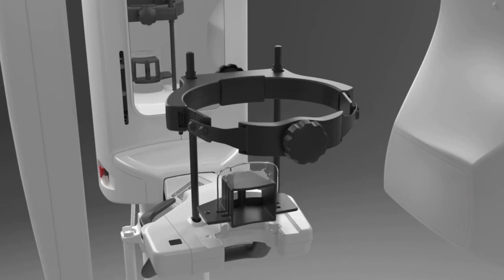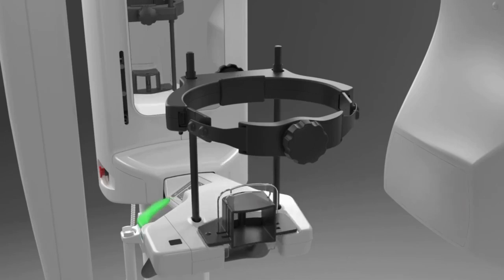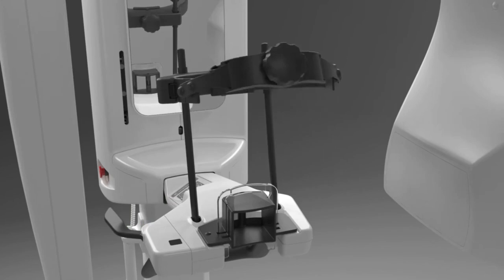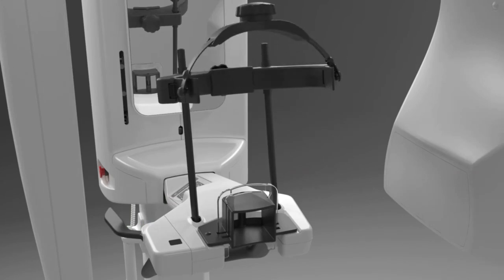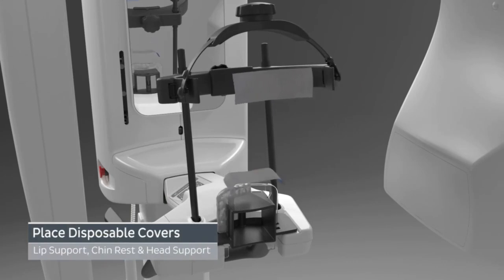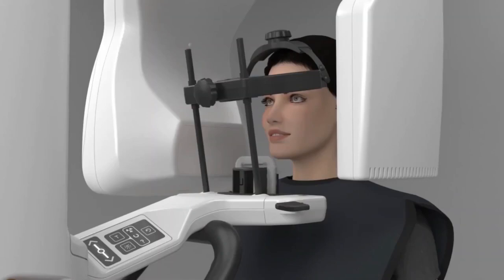Also, those moving solutions try to project the teeth arch as orthogonally as possible. It is impossible to select an ideal movement as the anatomy varies very much from person to person. Finally, a compromise is selected by each manufacturer and results in magnification factors which vary strongly along the film, 15 to 30%. The patient positioning is very critical in regard to both sharpness and distortions.